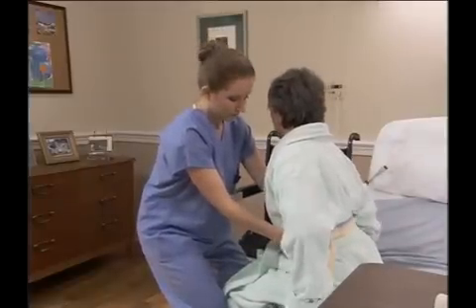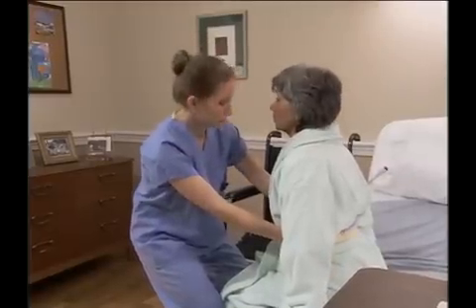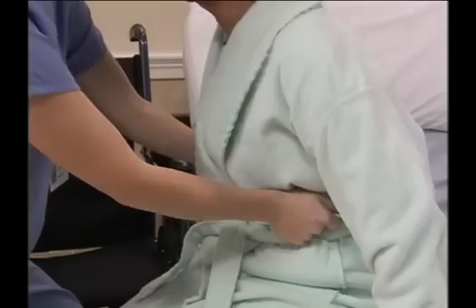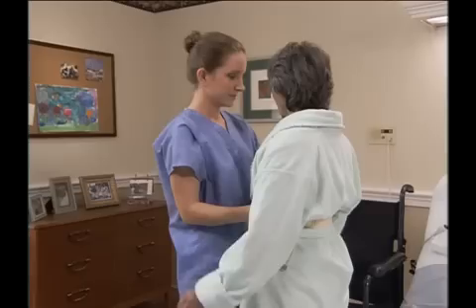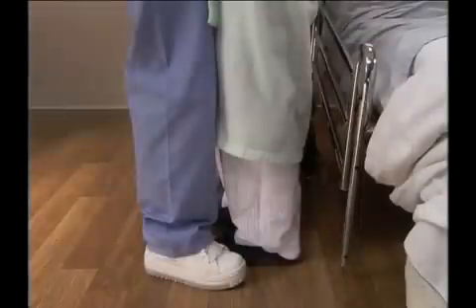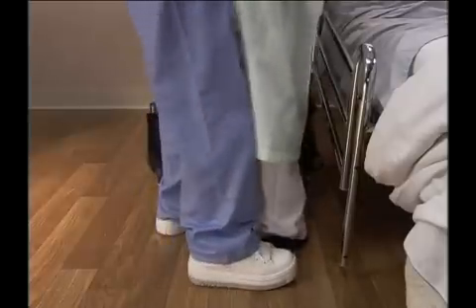Have the person push down on the bed with her hands and stand on the count of 3. On the count of 3, I want you to push down on the bed and try to stand, okay? Pull on the transfer belt as you straighten your knees. 3. Remember to keep your back straight. Support the person in the standing position by holding the transfer belt or by keeping your hands on her shoulder blades. Continue to block the person's feet and knees with your feet and knees.